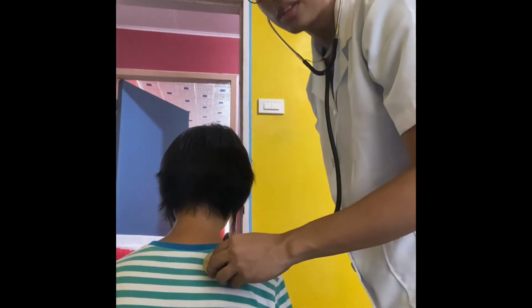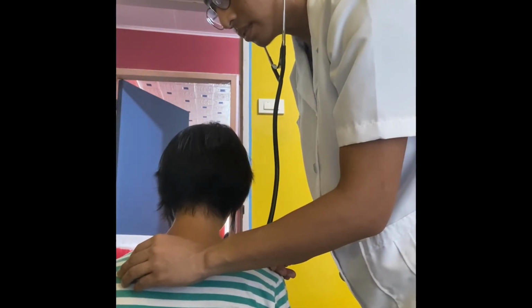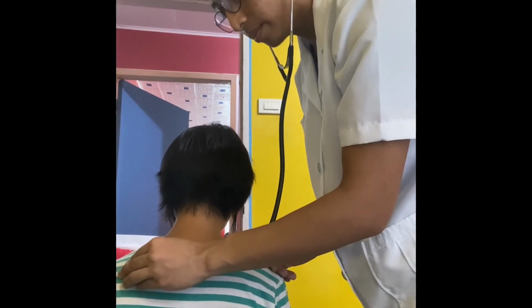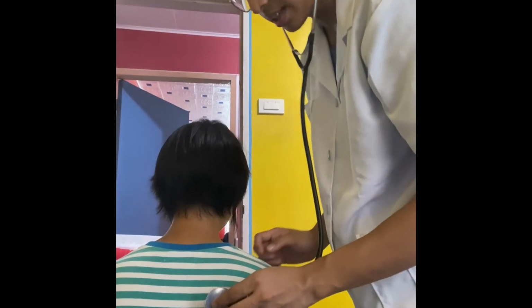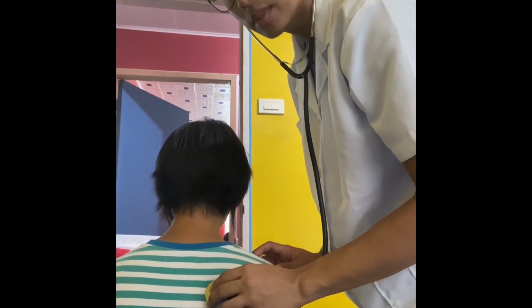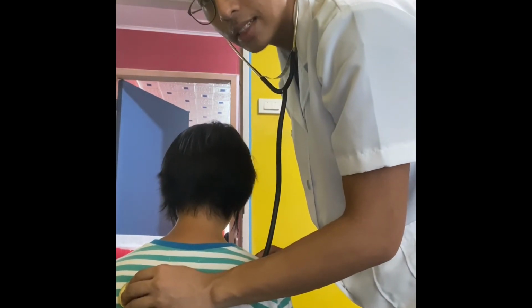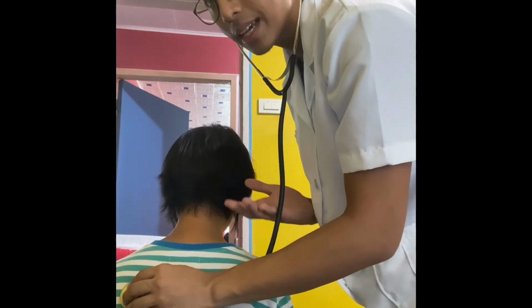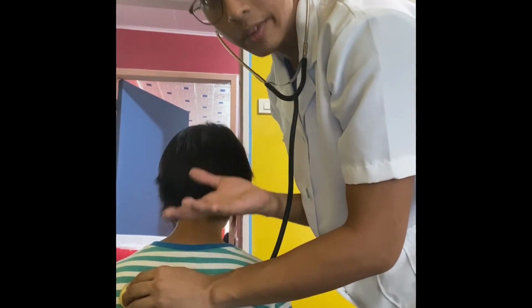Now moving on to the medial to the other side. Inhale, exhale, miss. Okay. Now moving on to the next landmark, which is medial to the scapular spine. Inhale, exhale, miss. Other side. Inhale, exhale. So we're assessing the posterior segment of the upper lobe when we're here in this landmark.